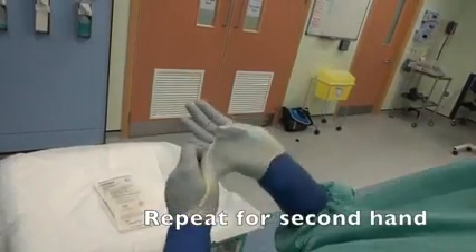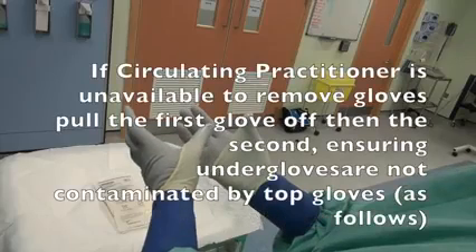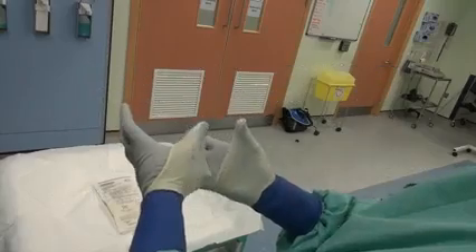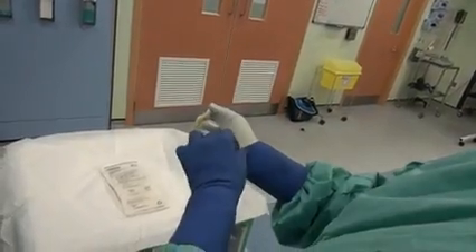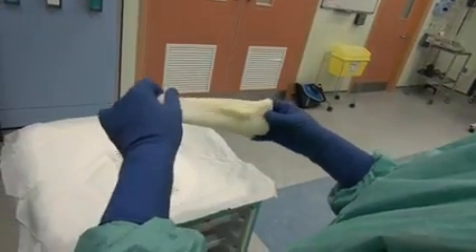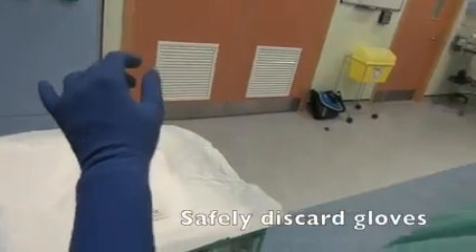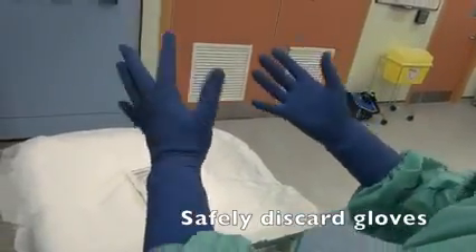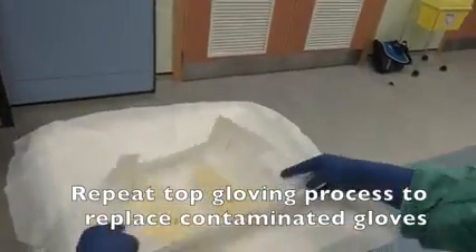Repeat for the second hand. If the circulating practitioner is unavailable to remove gloves, pull the first glove off, then the second, ensuring under gloves are not contaminated by top gloves. Safely discard gloves. Repeat the top gloving process to replace contaminated gloves.